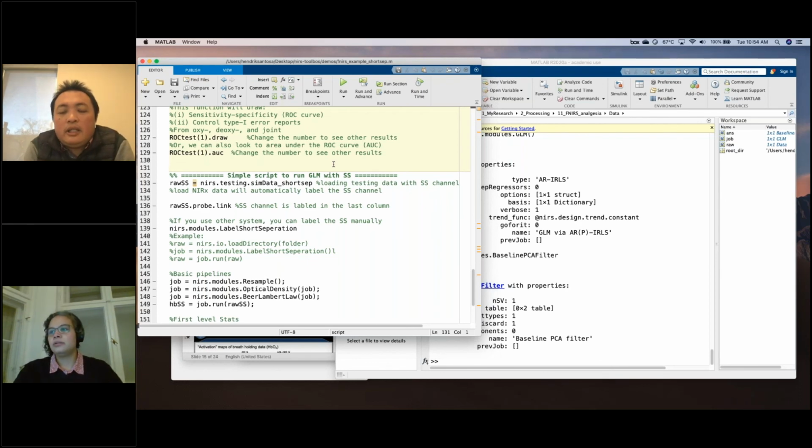Yes. Also, with the NIRx, I have never seen an experiment showing not-a-number data. So I think it should be okay. If lost, it just means noise for the channel, but you can still use that data. Okay, and the toolbox would be able to deal with this, right? Yes. Okay, good.